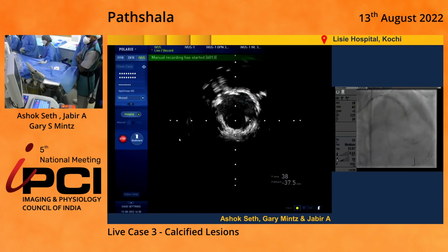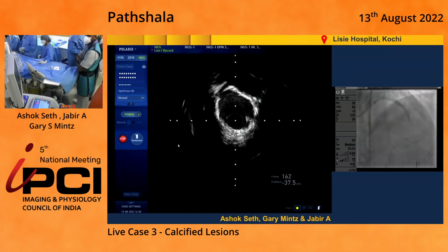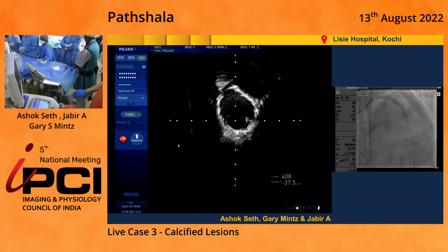So this is it. You add the double layer. Right, this is the best. And that's 5.2. Okay, so you got 5.2. So we bought about a square millimeter.